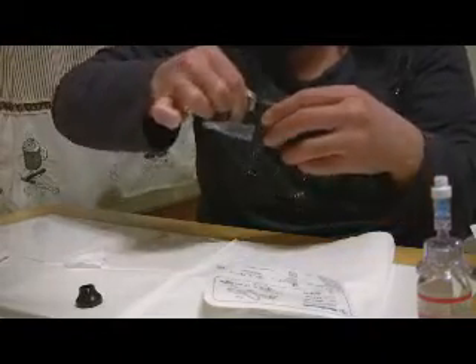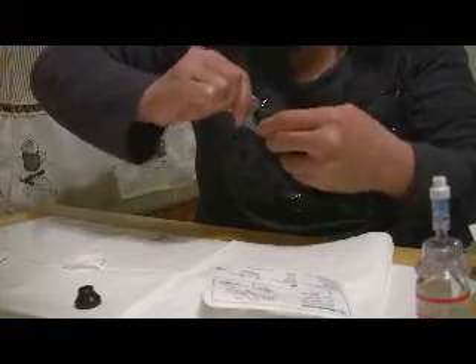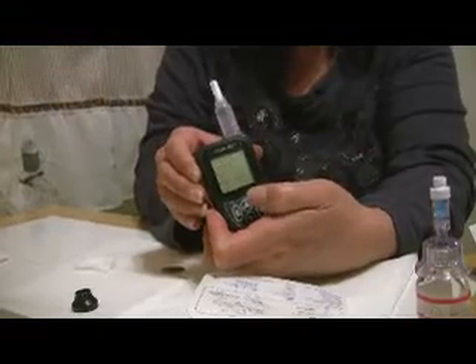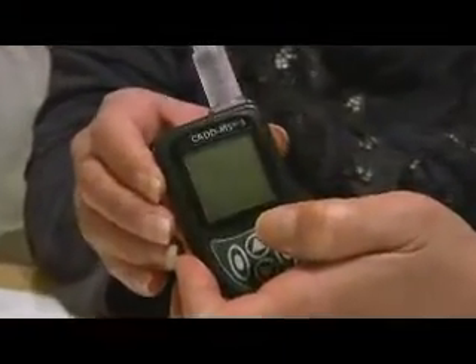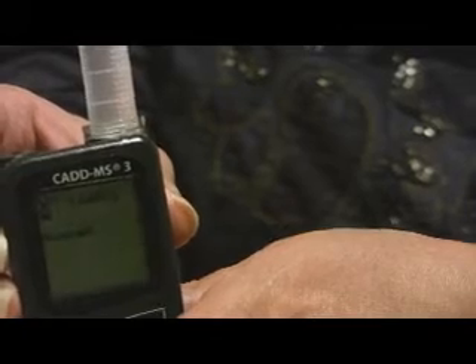You have to screw this on — make sure this goes on tight. As you can see, the pump is starting up. You can hear it as well. It tells us that the cartridge has been removed, so we just press the OK button, and then we press it again to load the cartridge. You can hear and see that the cartridge is going down.